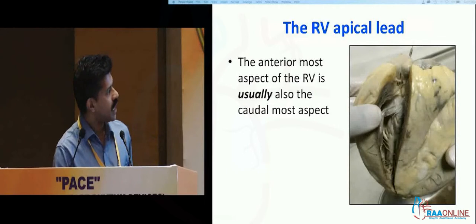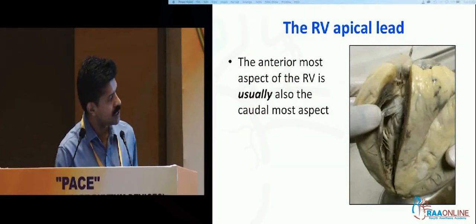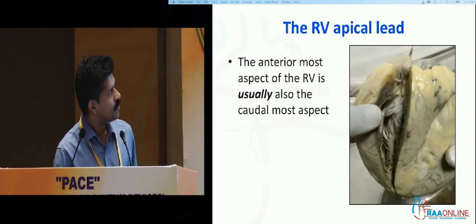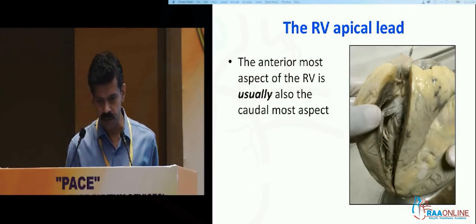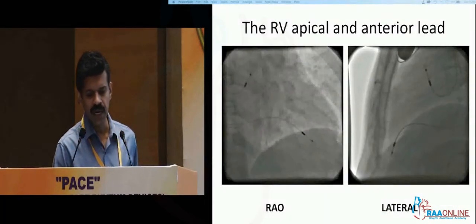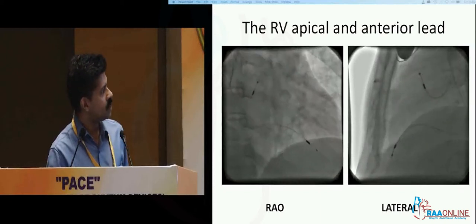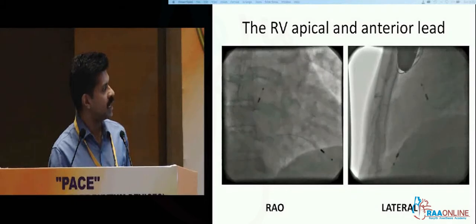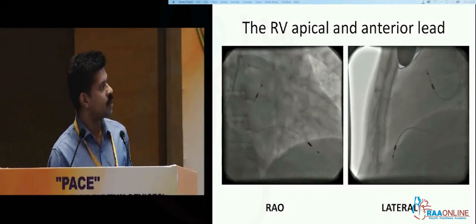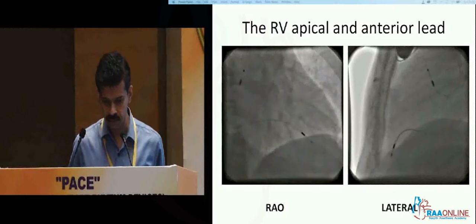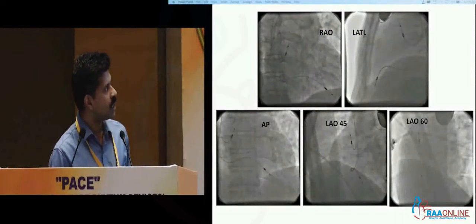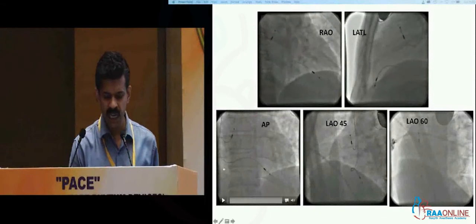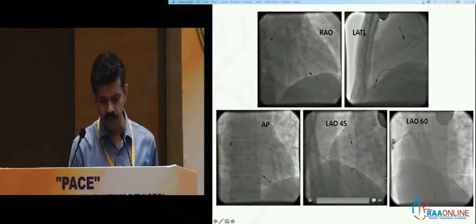For the RV apical lead, our idea is to get the lead as close as possible to the apex, because that's the most heavily trabeculated part of the right ventricle — usually the caudal-most and anterior-most aspect. So this is how an ideal apical lead would look: it will go down towards the dome of the diaphragm in the right anterior oblique, go almost to the anterior border of the heart in RAO, and in lateral it will look like it is virtually touching the sternum. The other views are not really conclusive of the apex.